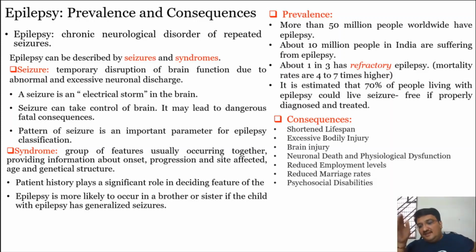function results in EMG. Now EMG is basically a muscle biopotential which has a far higher value than EEG. So there are very high chances that your EEG biopotential will get eliminated in between this EMG. Basically, the prominent waveform which you can see outside would be the EMG. The EEG would be there, but in a very small amount, and it's very difficult to extract EEG from EMG when a person is throwing a seizure.